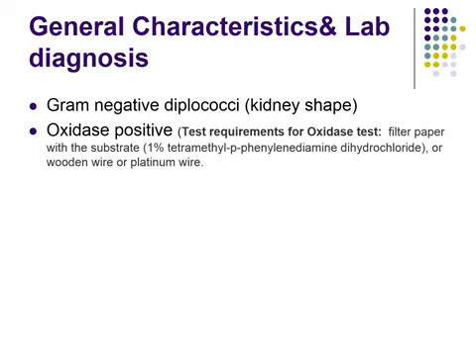The principle of this test depends on the ability of bacteria to produce indophenol blue from oxidation of the oxidase reagent. The oxidase reagent is called tetramethyl paraphenylene diamine dihydrochloride.